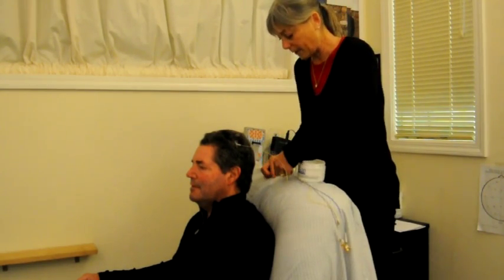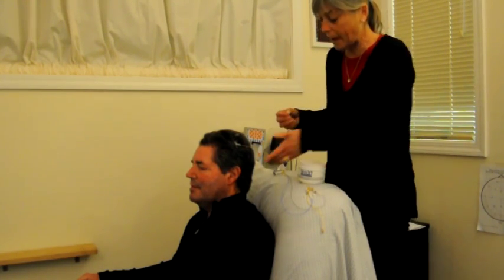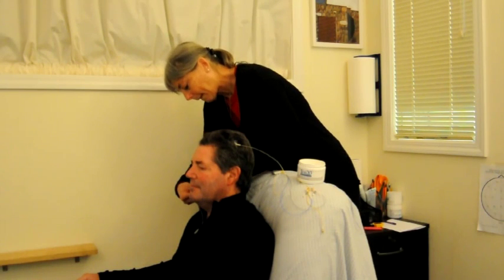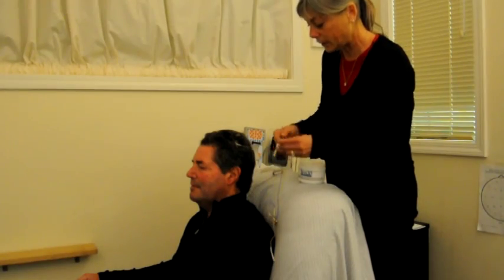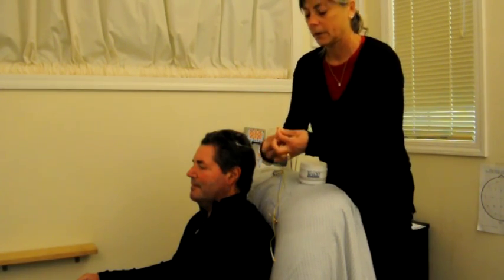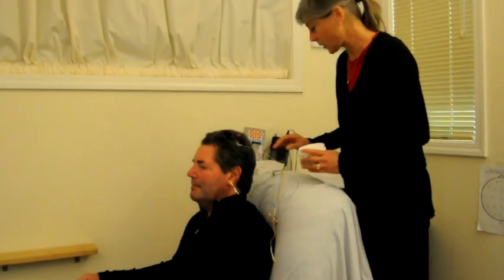So I've got C4 hooked up, and I'm going to find my reference sensor. I put the reference on the contralateral ear. Some people prefer the ipsilateral site, but I prefer contralateral. Some people prefer the mastoid — the bone right back here — not the auricular point, but I prefer the auricular point. So now I'm going to put my ground on the ipsilateral side and place it right on his ear, squishing it down a little bit. I'm going to look at my impedances on the screen to make sure he's got a good hookup.